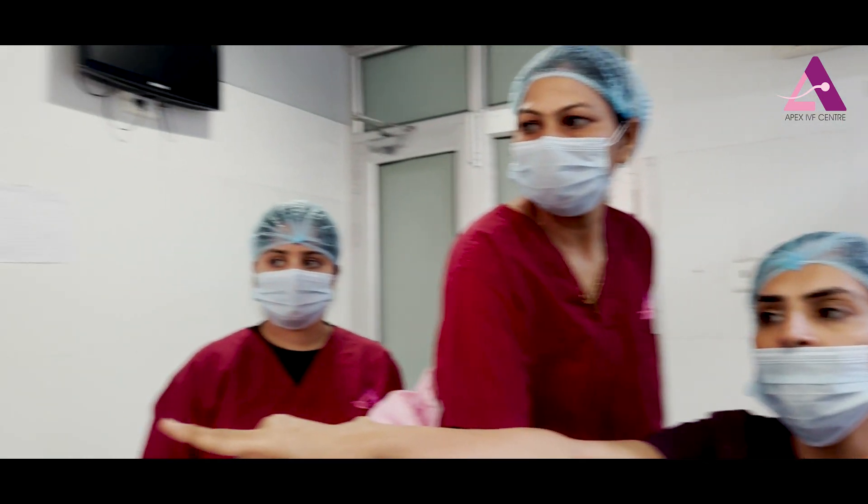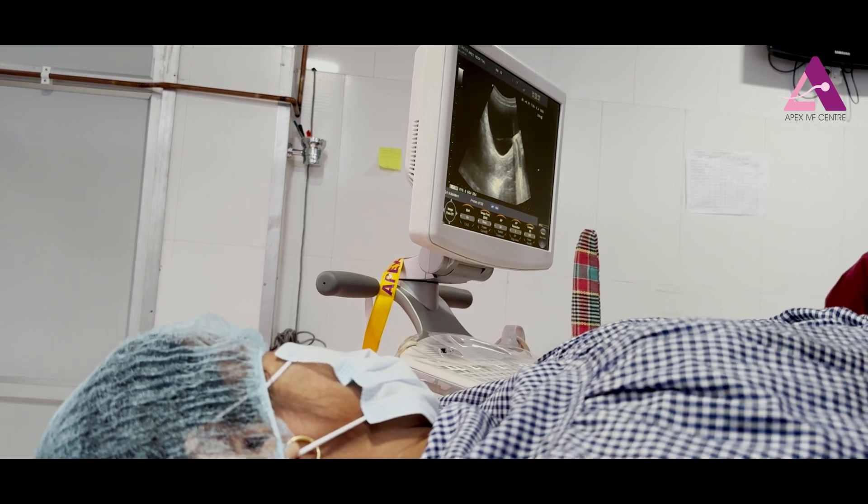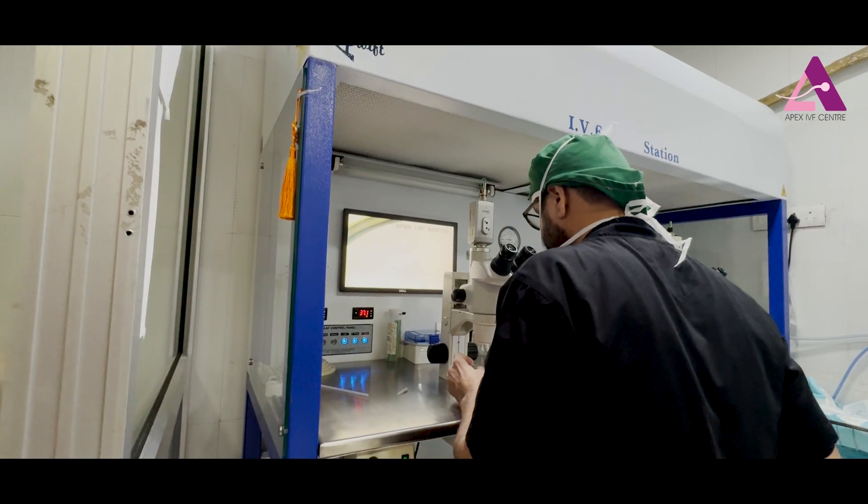The embryo transfer is done under ultrasound guidance, and the patient also looks at the screen so that she can see how the babies are going inside. The embryologist is loading the embryo.